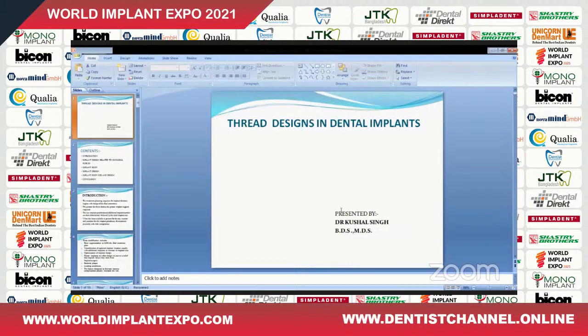And in optimization of dental implant design, the dental implant is often designed to answer a belief that implant failure may stem from the implant surgery itself, from bacterial plaque, or from the loading conditions. The features designed to decrease the bacterial complication usually increase the risk.